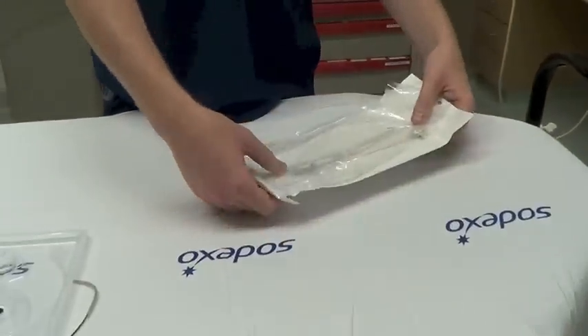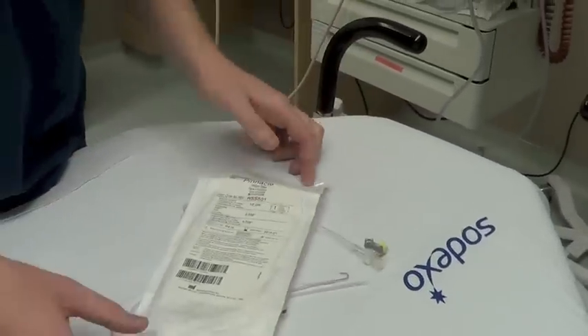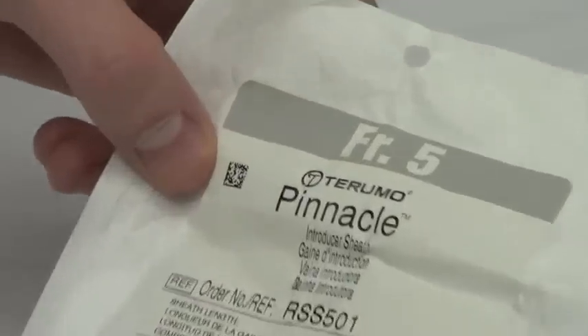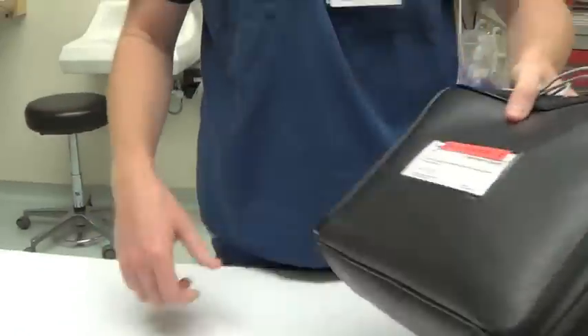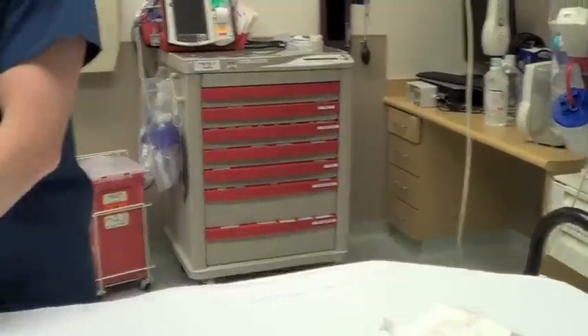We're going to show you the basic steps for putting in a transvenous pacemaker. There are a couple of key things you need to grab from the central line cart out in front of room 25. First, you need the five French introducer sheath. Sometimes you'll find it in this kit here which actually has your electronic pacemaker box.